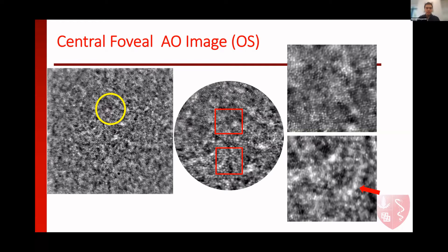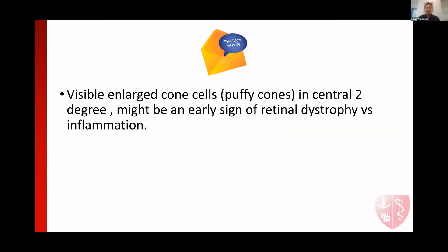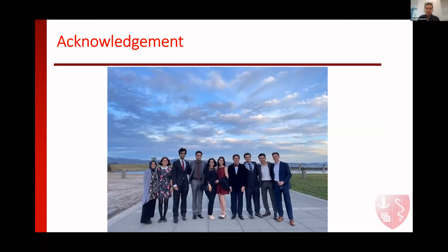Then we did a genetic test. She was tested positive for ABCA4, but the mutation was heterozygous — she was a carrier for ABCA4, not a full-blown Stargardt or RP disease. As a take-home message, puffy cones can be early signs of retinal dystrophy, even in carrier disease, as shown here. Since this patient still had some degree of inflammation, we cannot exclude the role of inflammation in this case — maybe the cones have been enlarged because of inflammation. We don't know.